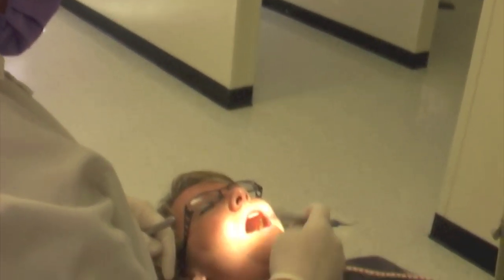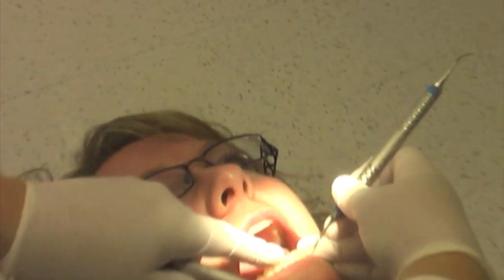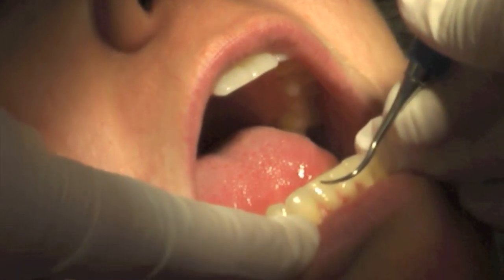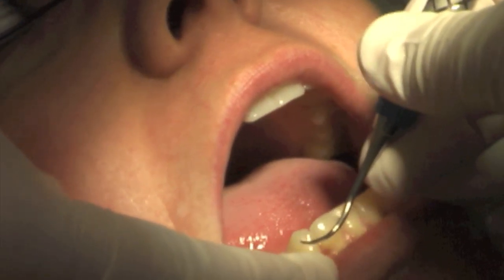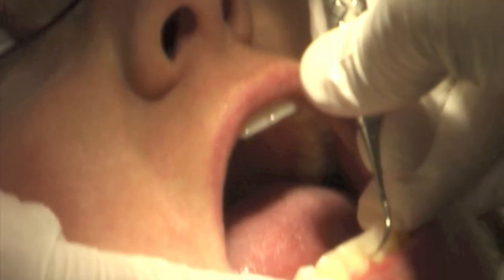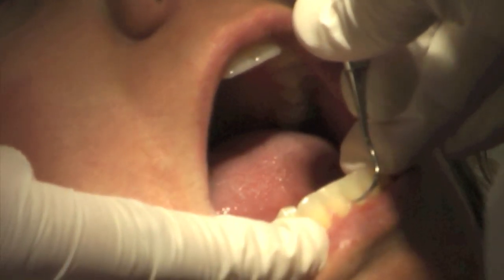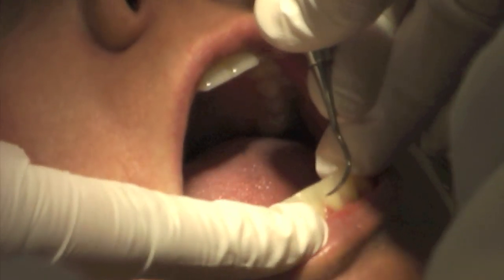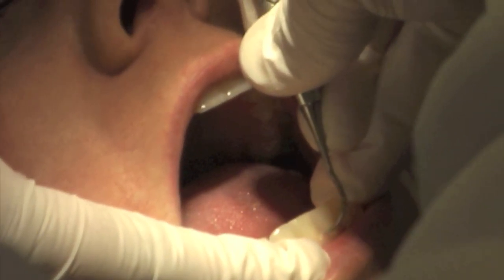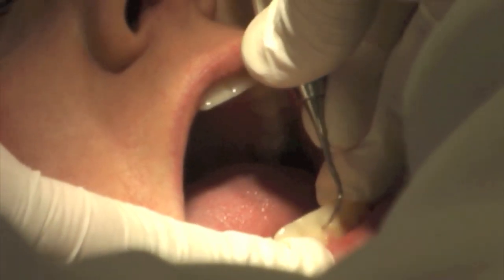When you're sitting at 8 o'clock, you're better able to access the mesials of 22, 23, 24 and the distals of 25, 26, 27 from this position. Because correct operator instrumentation requires that whenever you do a working stroke, you have to go laterally against the tooth. So if you're sitting correctly at 8 o'clock, you're able to go lateral, then go toward the toe and do your little twist from this position.